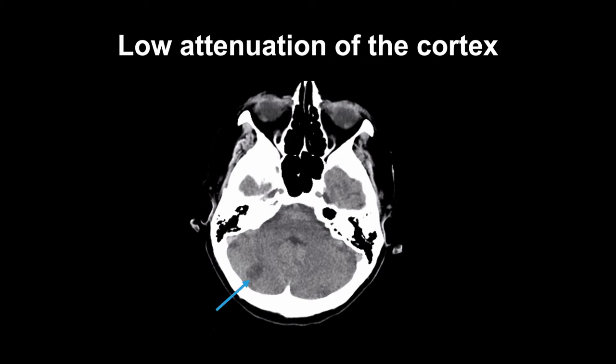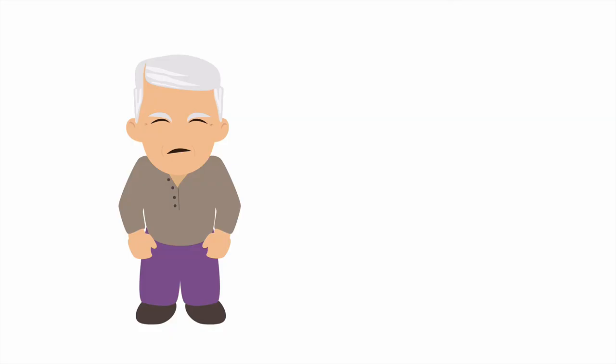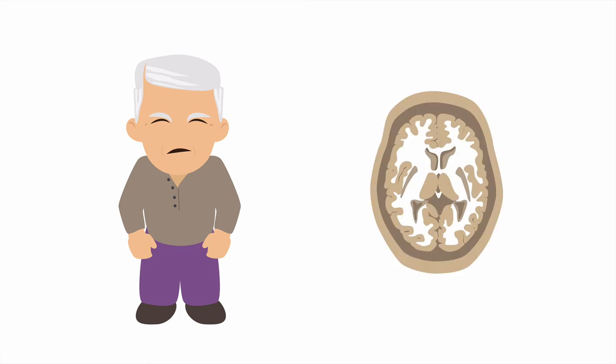A cerebellar infarct was evident on this patient's CT scan that proved to be secondary to a right vertebral dissection on vascular imaging. But this finding is often inapparent or artifactual, especially if there's age-related atrophy of the cortex.